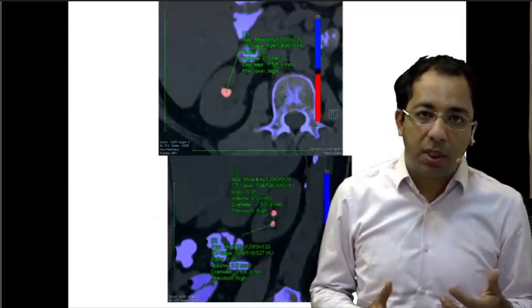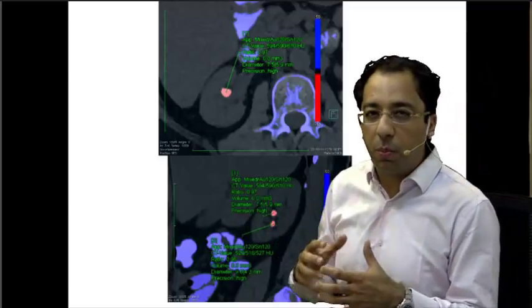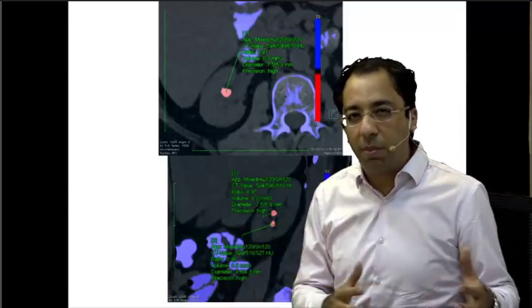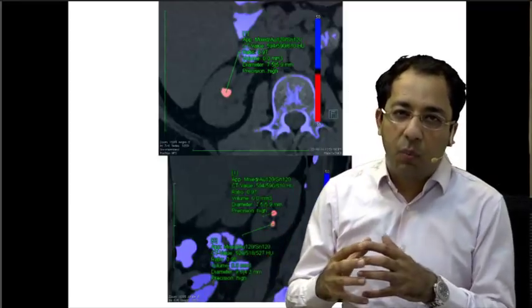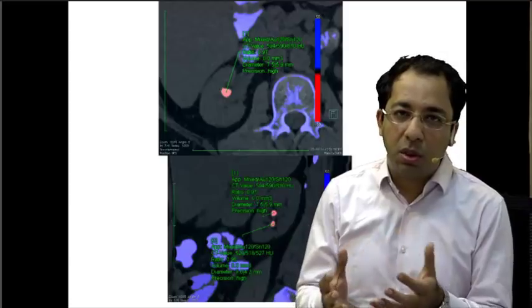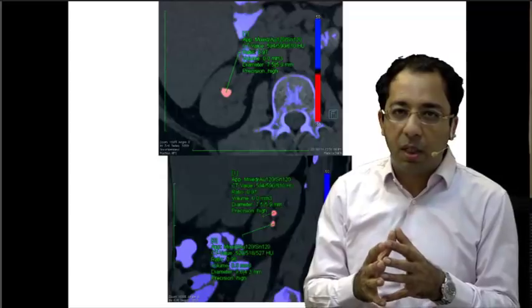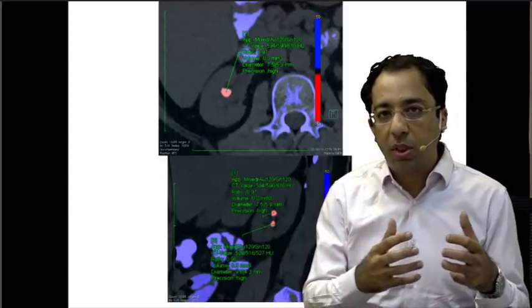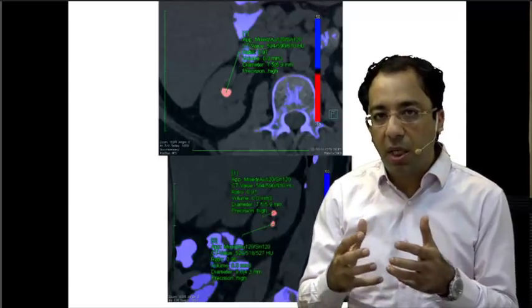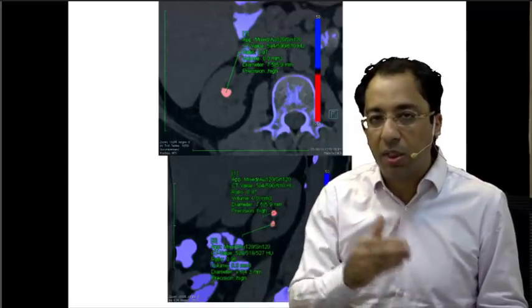And today we have a technology called dual energy CT, which could be a single source type or a dual source type, but we are scanning the patient at two different energies, and we are looking at how the attenuation changes when we use different kVp of X-ray beams. Now, for a soft tissue, that difference is not too important, but when we look at structures like stone, that difference in attenuation that we see at two different energies is able to help us to characterize the stones.